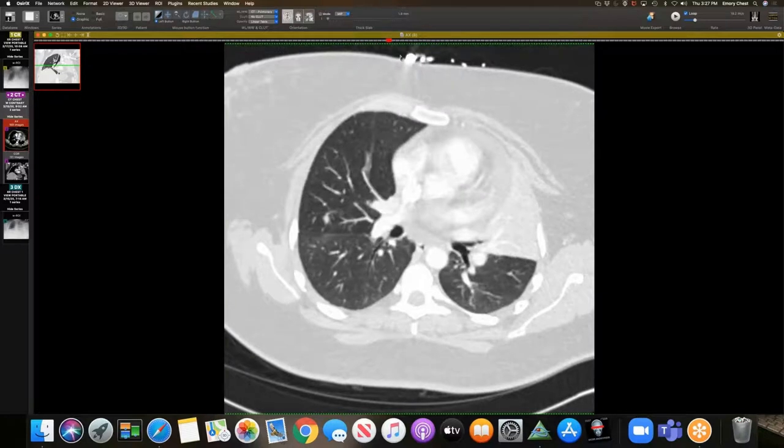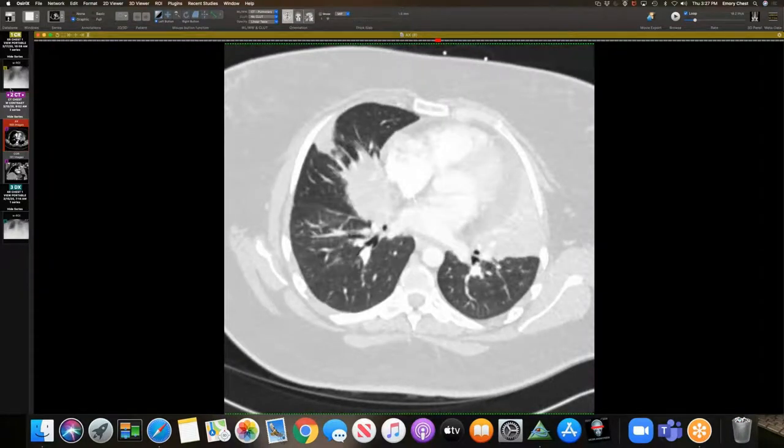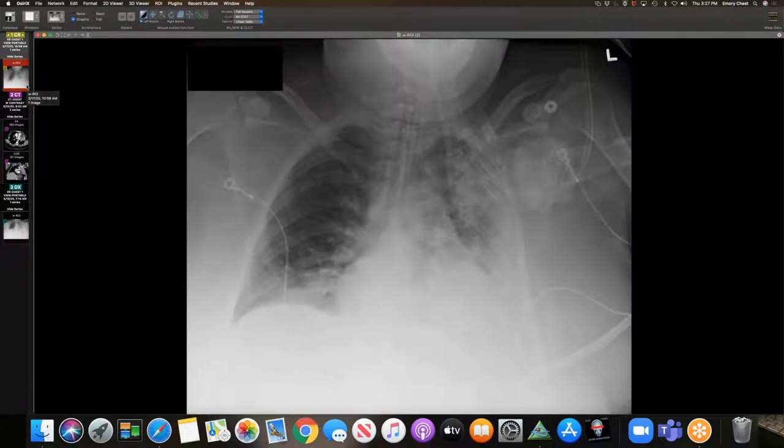So, Travis asked me, I posted four cases yesterday of COVID on CT with findings that were very reasonable for that. And there were another four or five cases that I didn't post because they had abnormal CT findings, but they were all other things. And you wouldn't think of COVID if you didn't have that COVID positivity from the nose. So Travis asked me what those other things were.